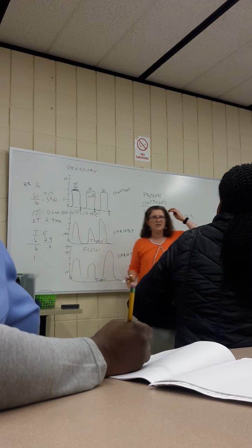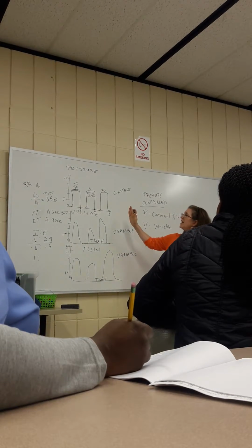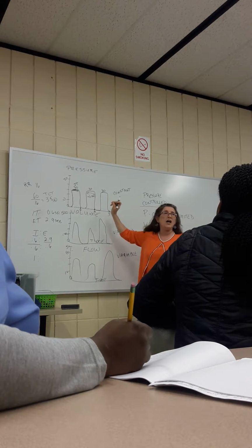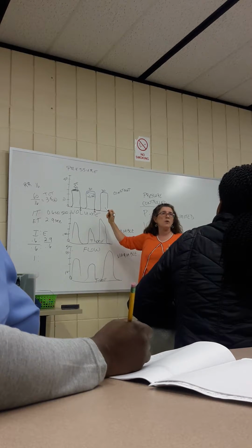We're just putting a little math in there. But if I have time scalars on there, there's no reason why I couldn't determine what my inspiratory time is. Okay?